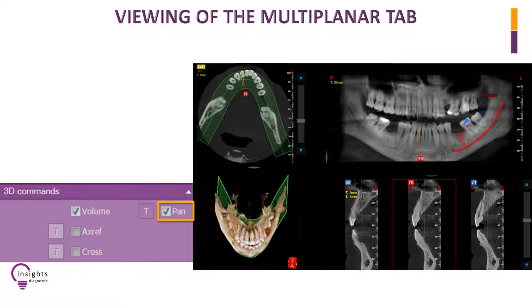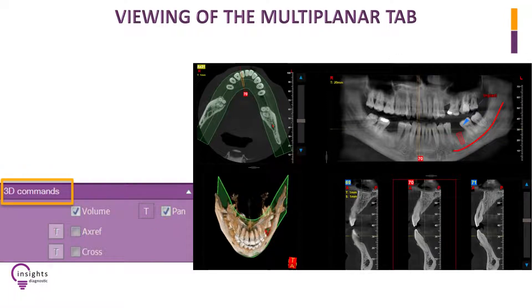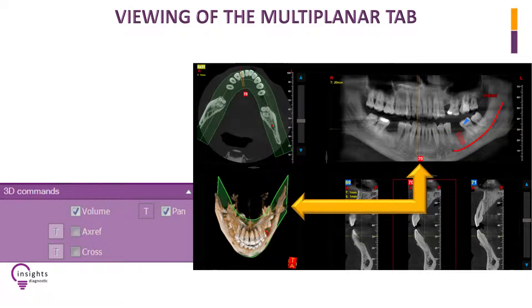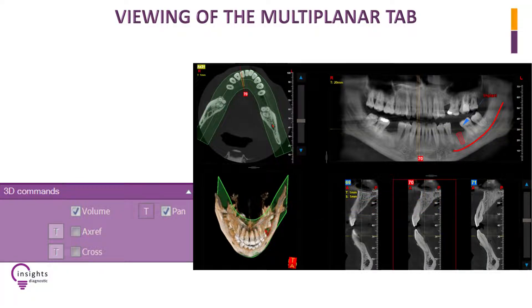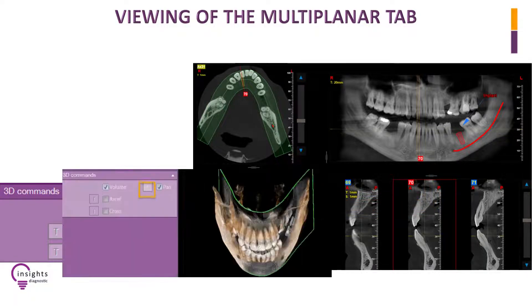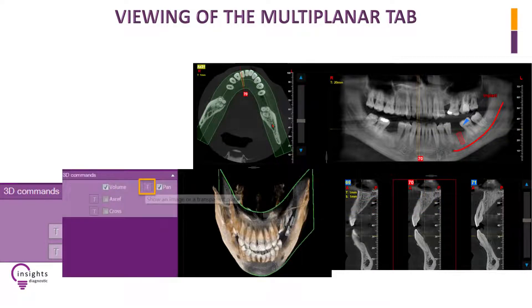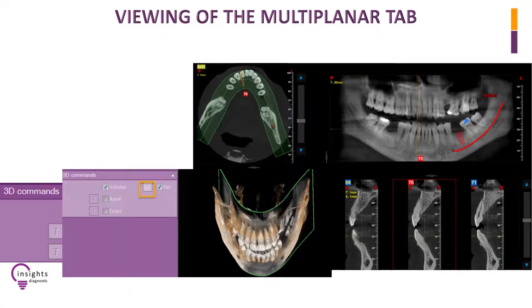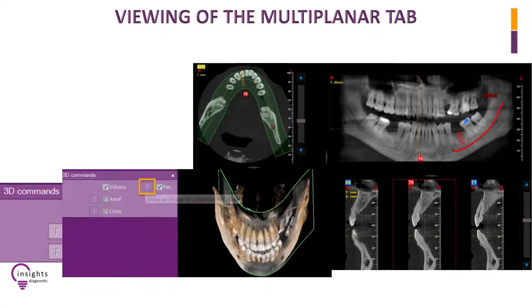Try clicking on Pan at the lower left corner of the toolbars under 3D commands, to see the green plane as the slice representation in the 3D model. Click on letter T at the adjacent left of Pan to make the green plane transparent.